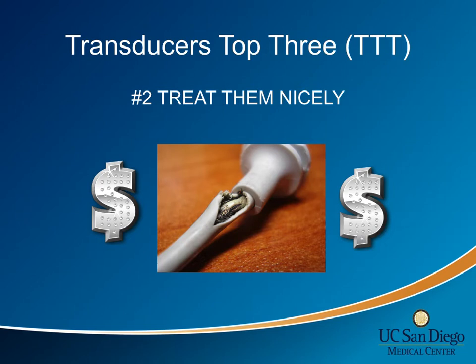2. Please be gentle with the equipment. These things are expensive and somewhat painful to replace. Please be mindful of cords. They are easy to run over. Also, any drops, chips, or cracks in the probes themselves can easily displace the crystals inside.